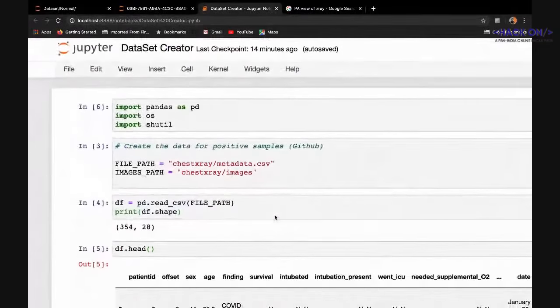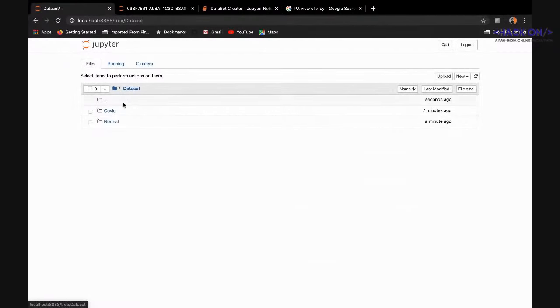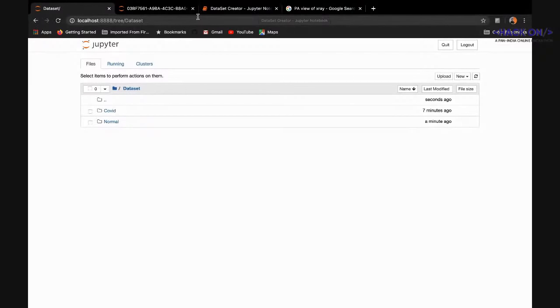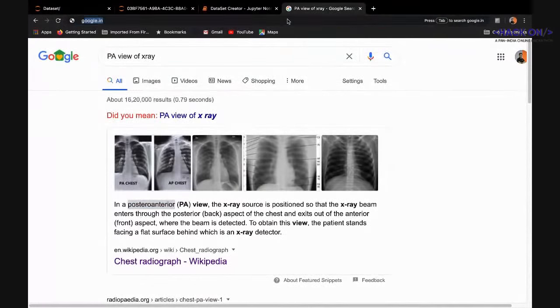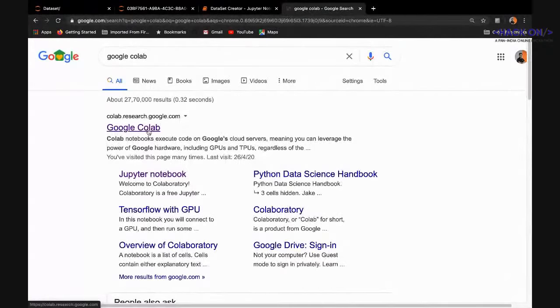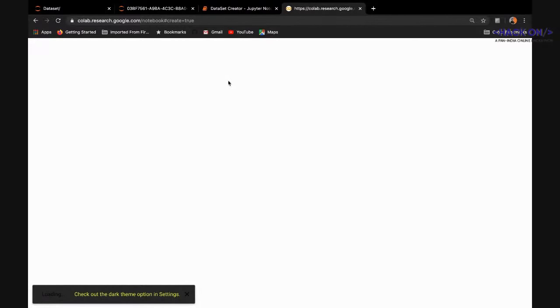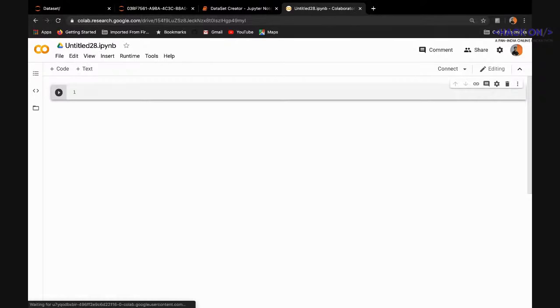Now that the dataset is ready, we divide it into training and validation parts. Since the image sizes are large, I'll use Google Colab to train the model. The data pre-processing was done locally, but the rest will be done on Colab. I've uploaded the dataset to my Dropbox from where I can download it directly into Colab.